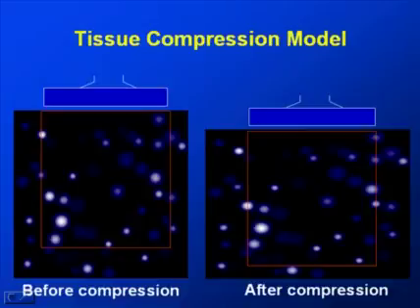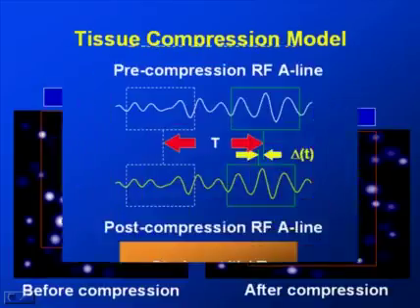But what's important to bear in mind here is that this extremely simple model also depends extensively on the boundary conditions. Essentially, if you take this slab of tissue and put it in a steel box, then no matter how much compression you put on it, objects aren't going to move laterally like this because the lateral motion will be constrained by the box. So it's not enough to say that tissues have a certain elasticity, that they're stiff or soft. It also depends on what the surrounding tissues are like. If tissues are very soft but surrounded by hard tissue, you will not get to move it around as much as if you have hard tissue sitting in a lot of soft tissue. So it depends not only on the properties of the tissue itself, but also on the structure and organization of the tissues around them, the boundary conditions.